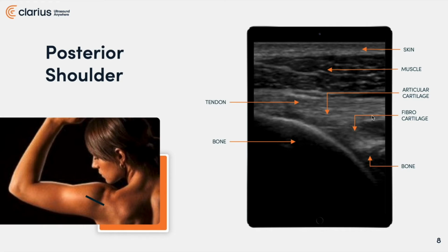And on this picture here, that infraspinatus muscle would be located in this region, and the tendon would span the back of the glenohumeral joint and attach to the middle facet on the greater tuberosity. If you look close, this sphere is the articular surface of the humeral head. So you're already starting to make out that this particular structure here is the glenoid socket. It's the part of the scapula that holds the humerus into place.